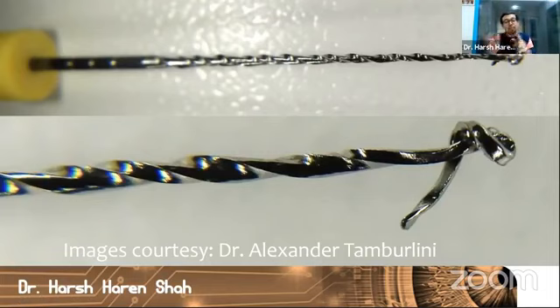One thing I want to tell you, another advantage or disadvantage, I don't know how to put it. Like we already discussed, you remember that elephant picture that I've shown you, where we will be putting any glide path file in the root canal system only after a number 10K file has reached up to the complete working length. Well, let's go back to that. Let's say your number 10 K file did not reach the complete length and your root canal was blocked in the apical third. And you just decide, let me just put my 1G file in the canal.